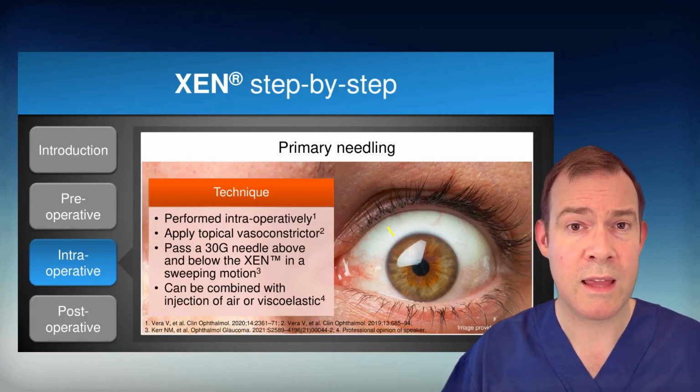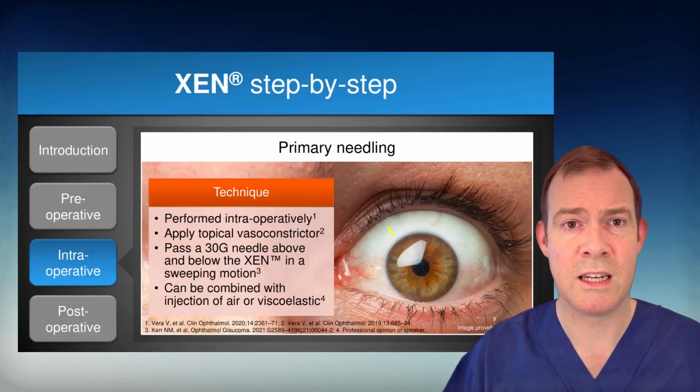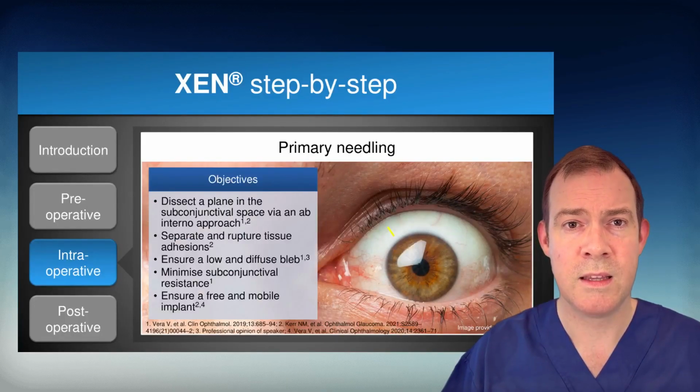Primary needling is performed at the time of theatre. A vasoconstrictor is applied preoperatively, and a 30 gauge needle is passed above and below the XEN in a sweeping motion. This helps dissect that subconjunctival space, separating and rupturing tissue adhesions. This helps ensure a low and diffuse bleb and minimizes subconjunctival resistance to help maximize IOP lowering.